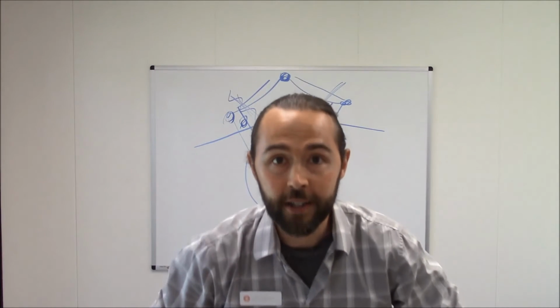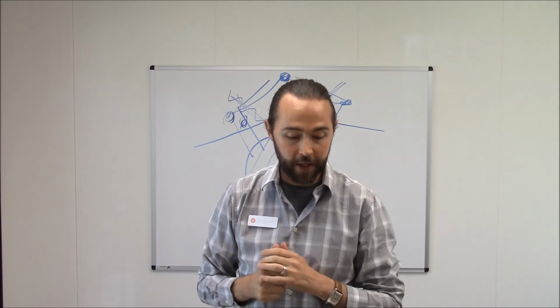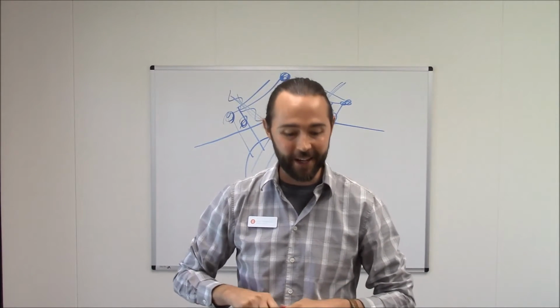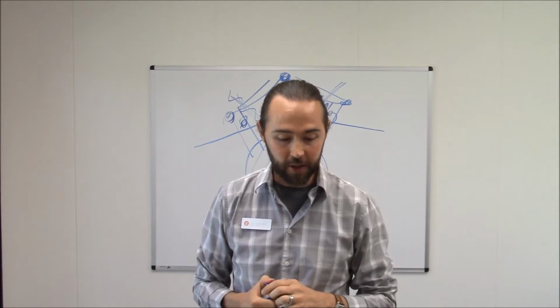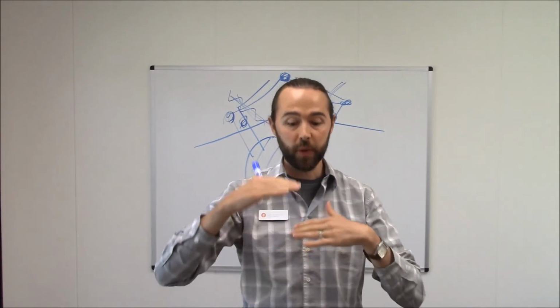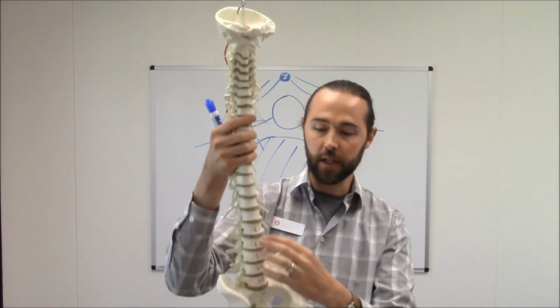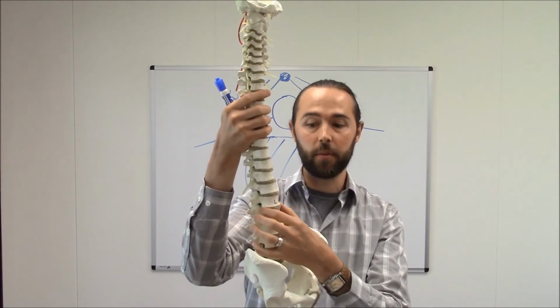Let me check on our time here. The video's getting pretty long, but I'm just going to run through two more, so feel free to jet out of here if you need to. Spondylosis is just degeneration between the two bones in the spine. You'll see it on x-ray pretty clearly around the edges of each of the bones. It's another degenerative change that you can see.